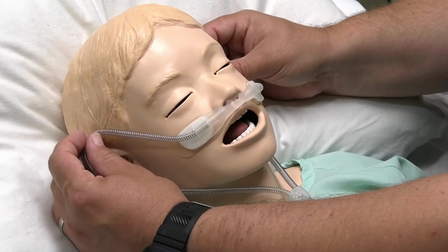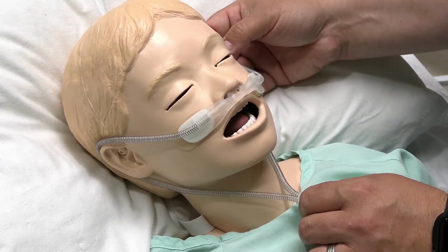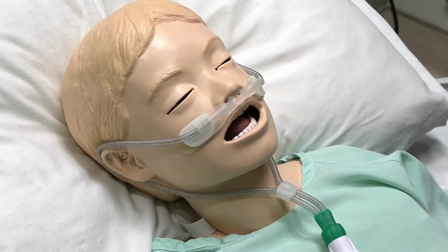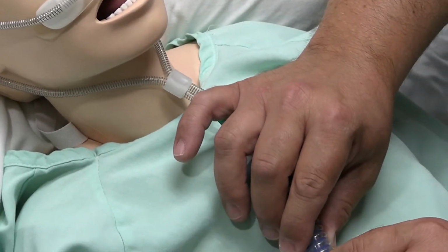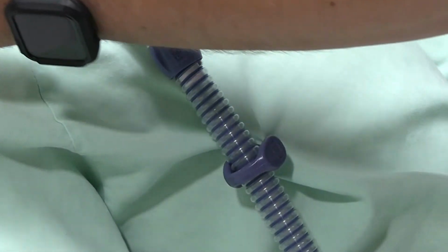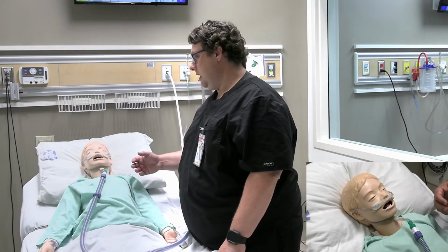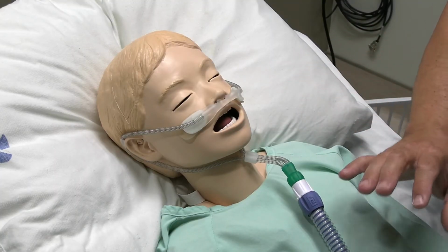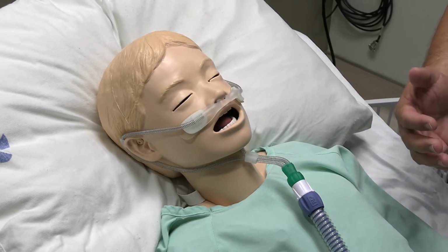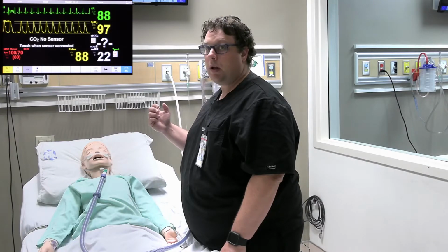And then we'll take our prongs, just like we did with our regular nasal prongs, and you want to try to loop it around your patient's ears and then just adjust it for comfort. And again, with the mannequins, not always cooperative. And then the other thing that we can do, because the circuit is actually quite heavy and bulky, is you can then clip it onto your patient's gown or shirt or bedding, just to hopefully take a little bit of tension off. We now have our patient settled and the nasal prongs are fitted appropriately. We have our clip attaching the patient's circuit to the patient gown. You'll notice that the patient looks up and appears to be quite comfortable, breathing quietly, and your vitals are normal up on the screen here.